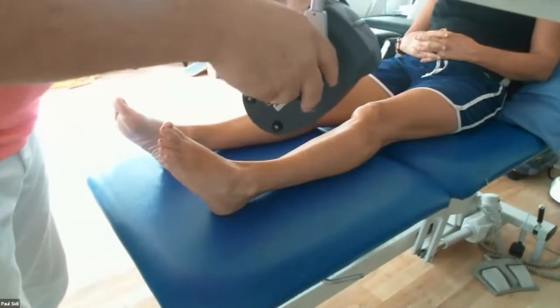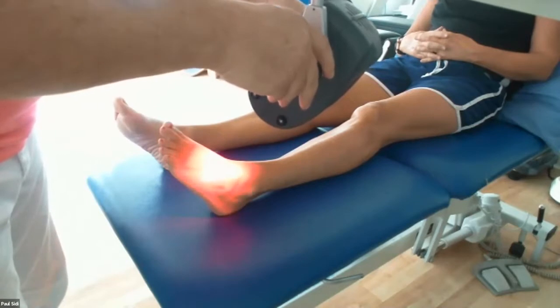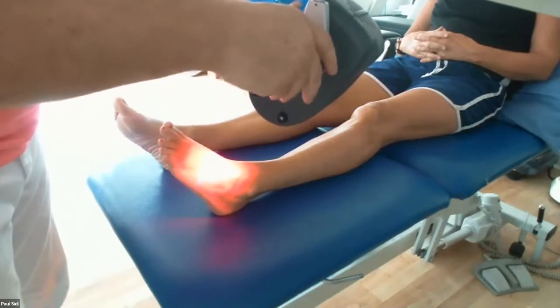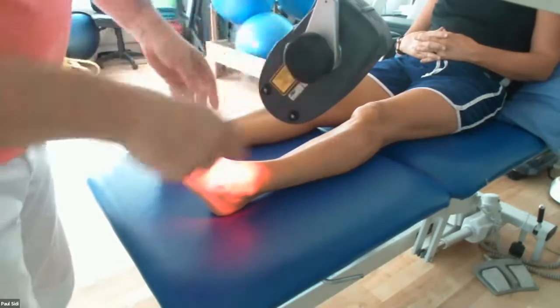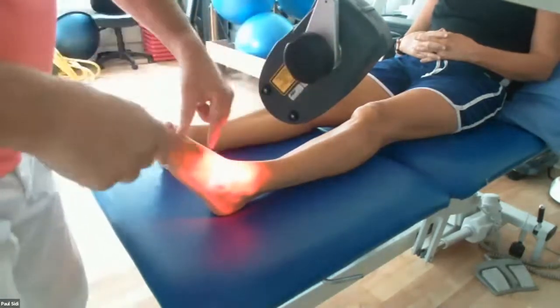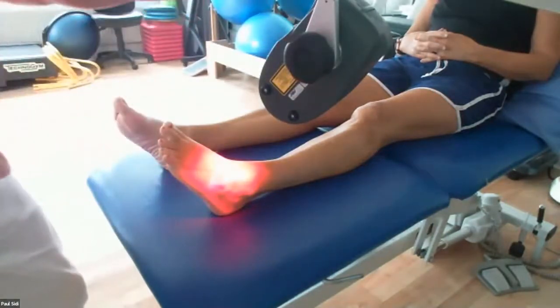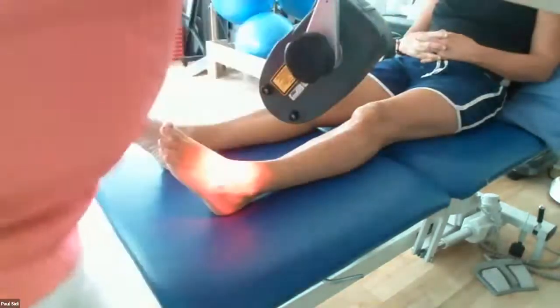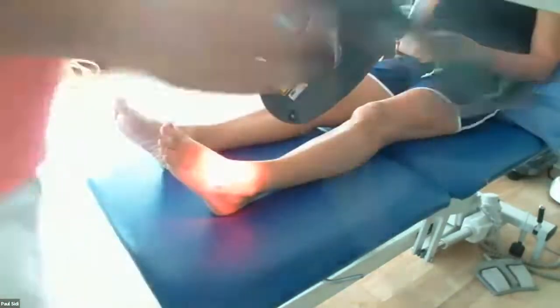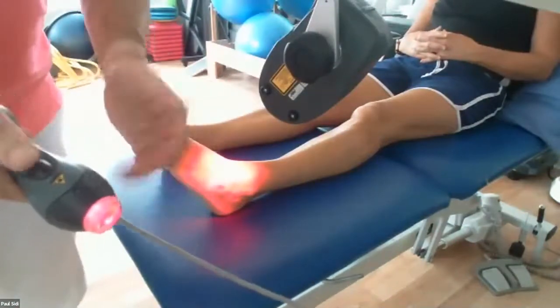Okay. And let's start that. Okay, I'll press the button there. So, beautiful. Now, what it'll do is it has 2 points, so I'll just move it here and just move it a bit further down. Right, I can now go and have my cup of tea, or I've already set this up. I can go and treat her neck. So if I just press that, then I start treating the neck.